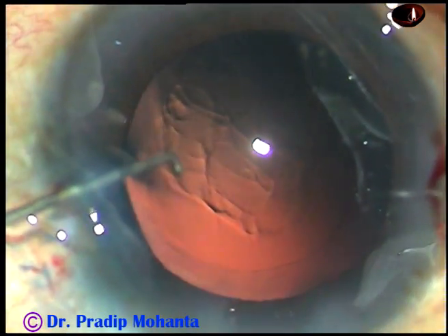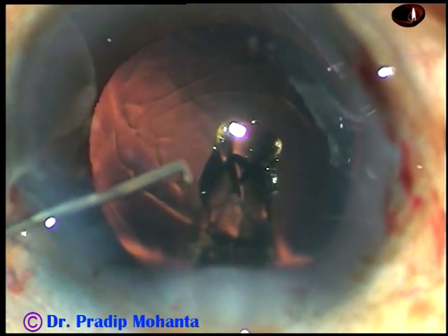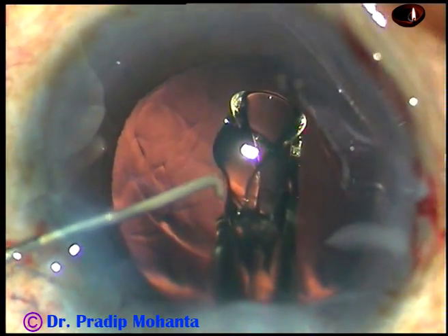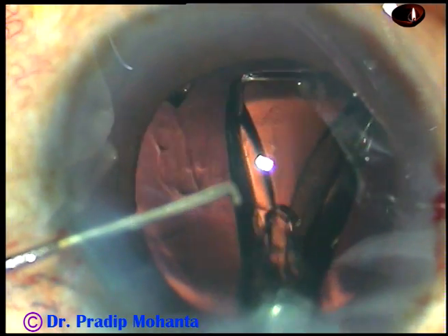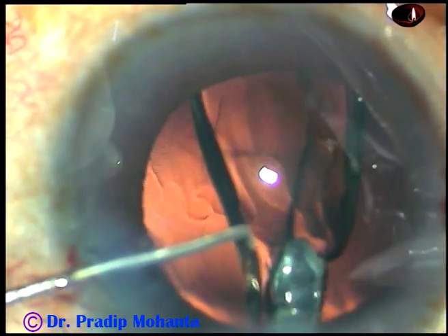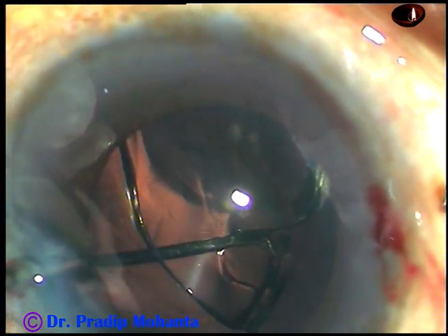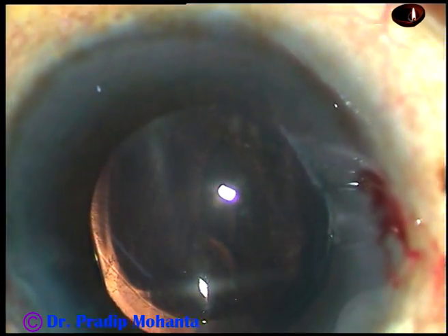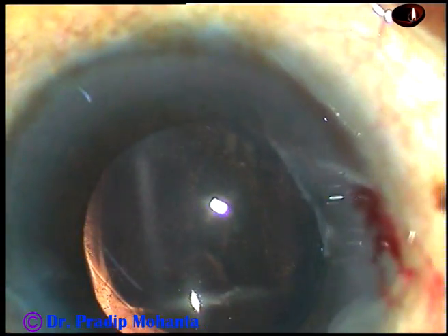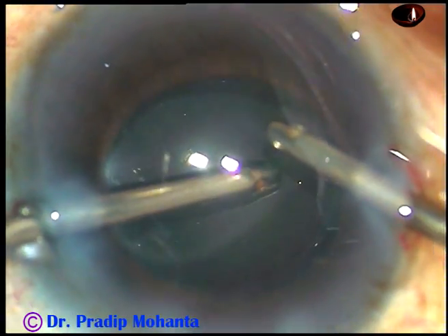Now, in this case, after cortical clean-off and injecting visco, this is a foldable, monofocal intraocular lens being placed in the capsular bag. You can see this is a hydrophobic acrylic intraocular lens — it is Supraphove from Appasamy Associates.